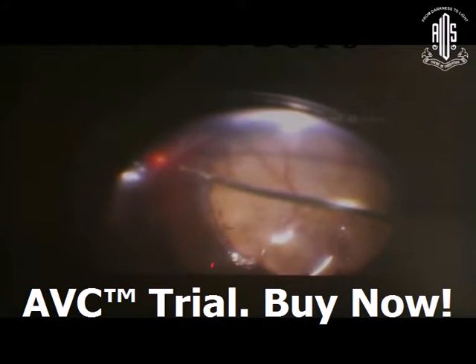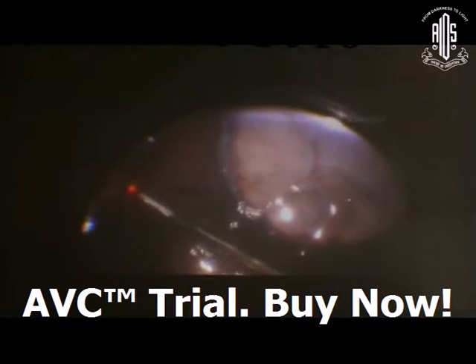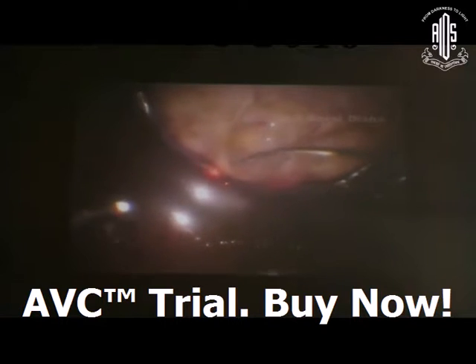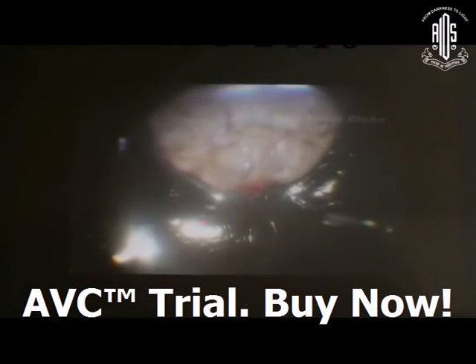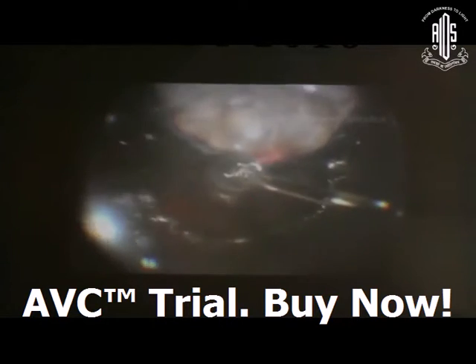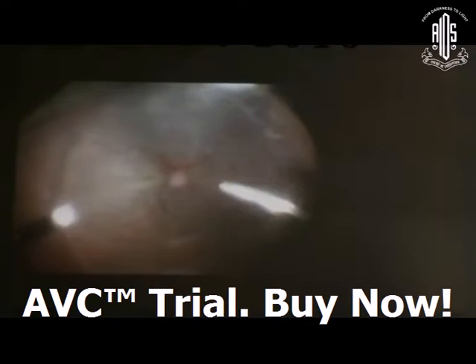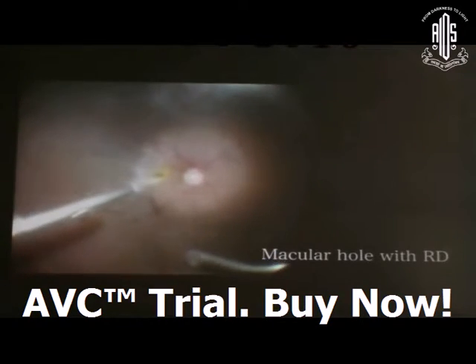Laser should cover all 360 degrees at the periphery as well as the margin of the choroidal lesion. Be very careful while doing laser at the macular area, because these patients may have only one eye. You should do only one or two rows of laser at the margin of the lesion especially at the macular region.